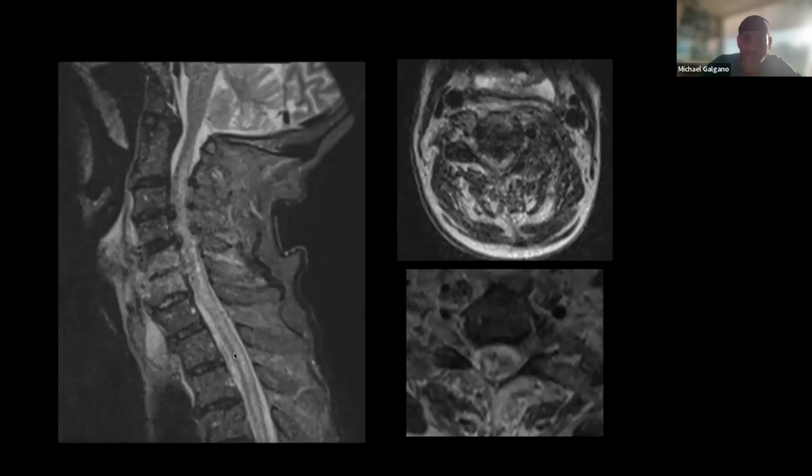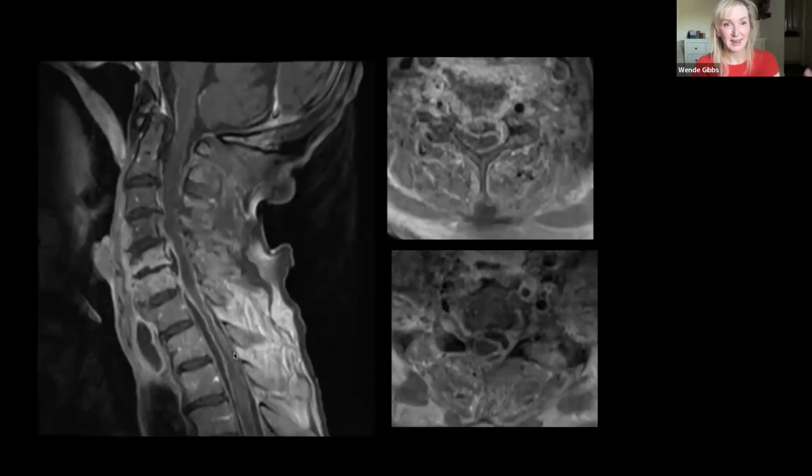So this was his T2 MRI scan that he had. And this was his contrasted film. So what are your thoughts about this? Wow, yeah. So both of those bodies, that is the post. So then no disc enhancement really, but ventrally there's that enhancement that's probably eaten through.